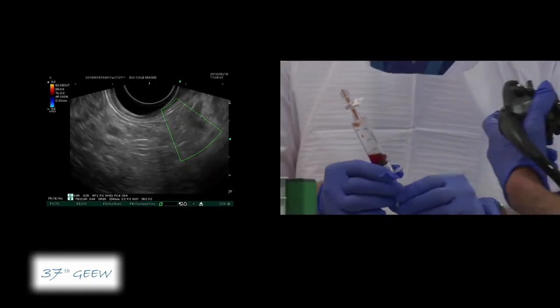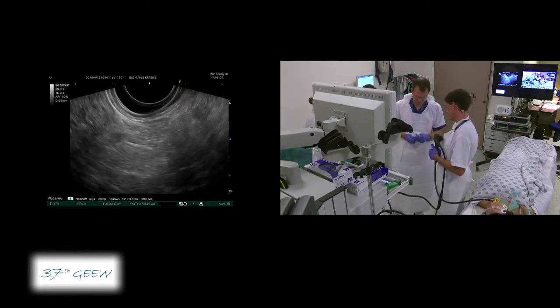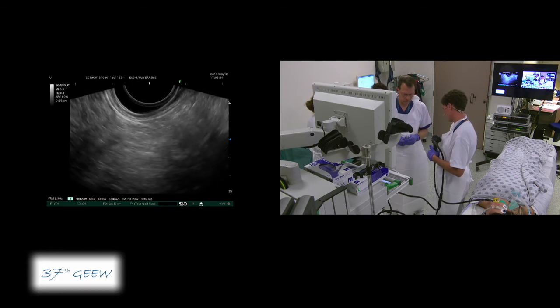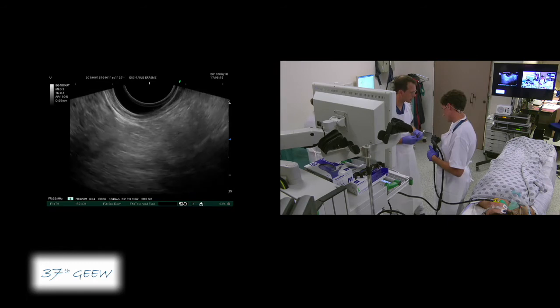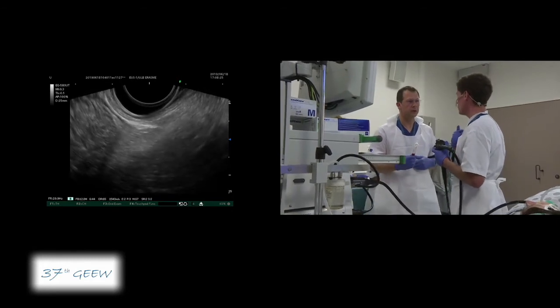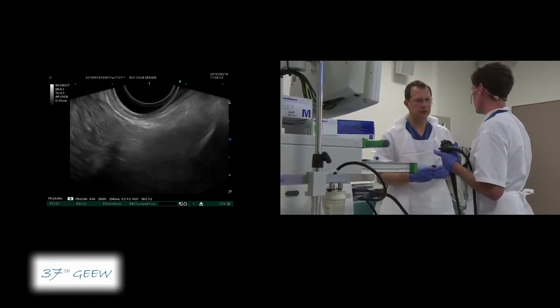Maxime and Pierre, just a small question, because on this specimen we want to have a cytology and we want to have lipase and CEA measurement. So do you have a process to do a centrifugation and to separate, to send one to the chemistry lab and the other one to the pathology lab? I don't know. In my unit, we have to separate ourselves. Okay. Put some in biochemical analysis and the other in cytology.